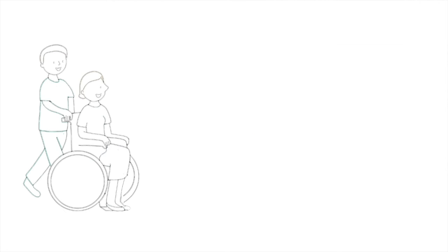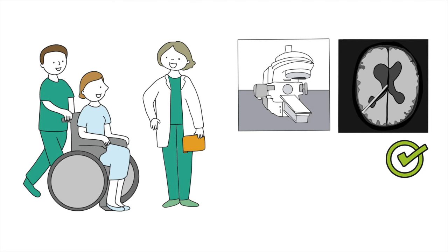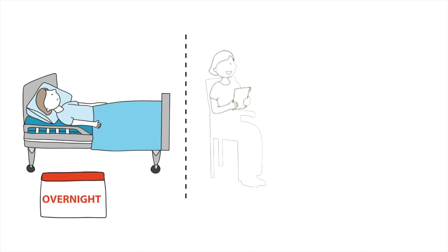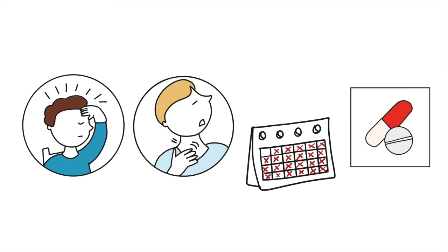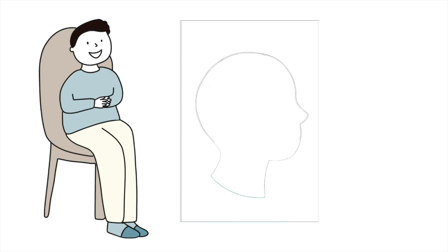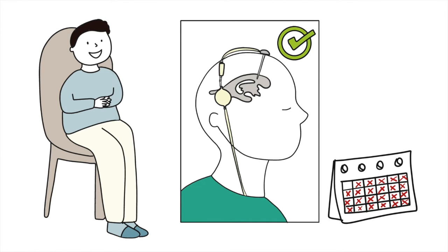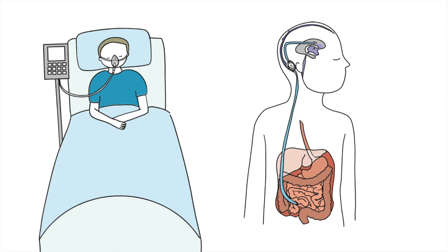After surgery, you will have a CT scan performed to visualize that the catheter is in the desired location within the brain. Most patients will be watched overnight in the hospital and are safe to be discharged from the hospital within 1 to 2 days, barring any other medical conditions or complications. Most patients have soreness for several weeks that is managed with pain medications prescribed at discharge. Often, patients feel better immediately from their hydrocephalus symptoms with placement of the shunt. However, it may take several weeks for the cerebrospinal fluid pressure to normalize. In some instances, symptoms may not improve if the hydrocephalus has caused permanent injury to the brain.